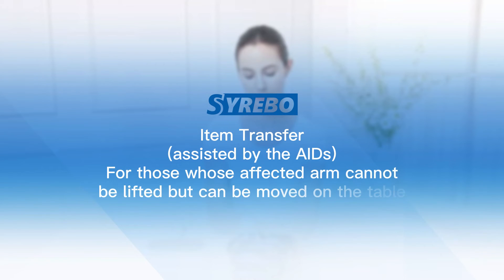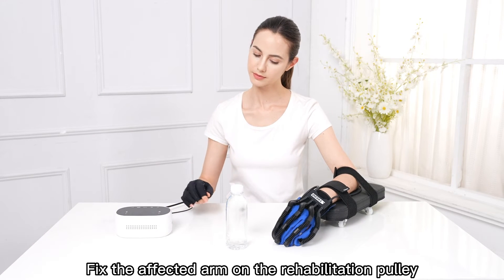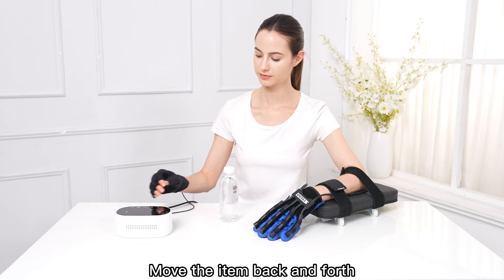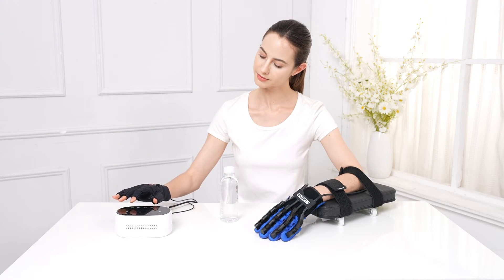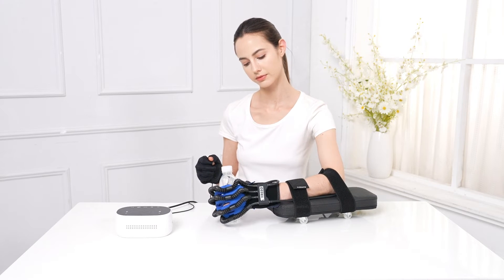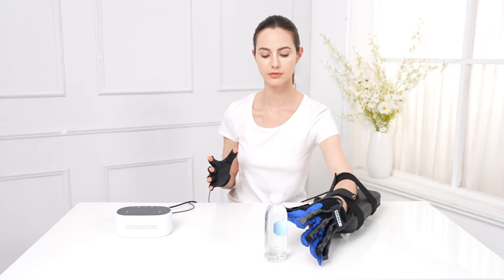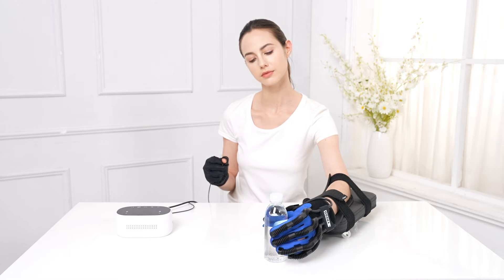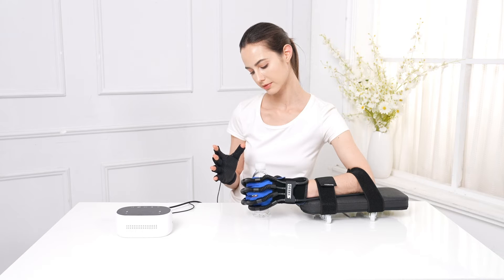Item Transfer — Assisted by Aids. For those whose affected arm cannot be lifted but can be moved on the table. Fix the affected arm on the rehabilitation pulley. Move the item back and forth. Stretch the affected arm as straight as possible. Do not shrug.